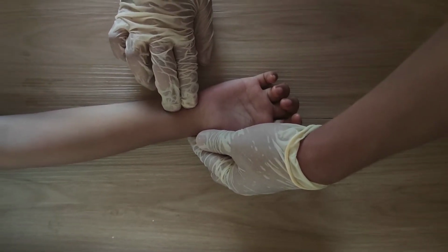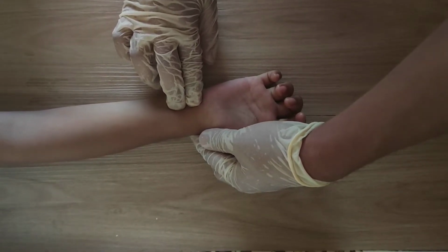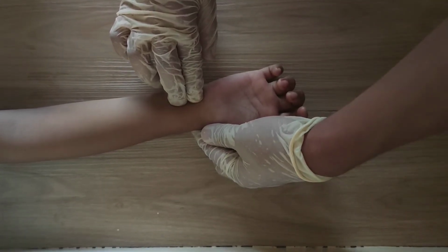Perform the Allen test or modified Allen test, or use a Doppler instrument to determine ulnar and radial artery patency. Collateral circulation to the hand is provided by the ulnar artery. The Allen test asks for ulnar artery patency.